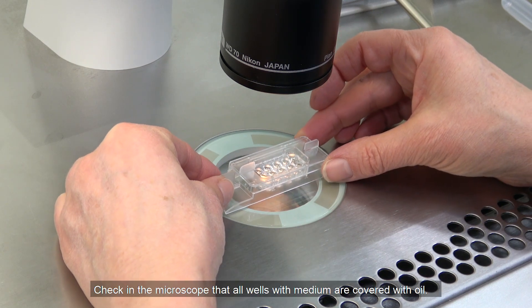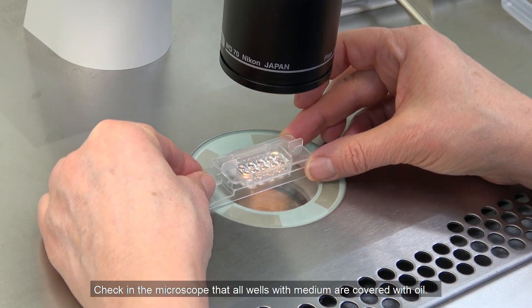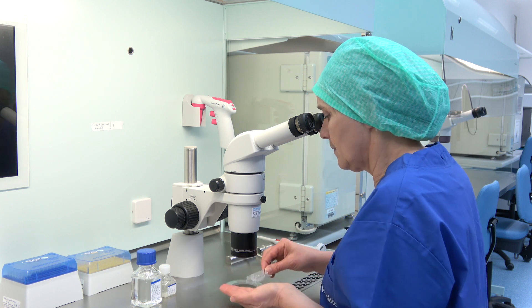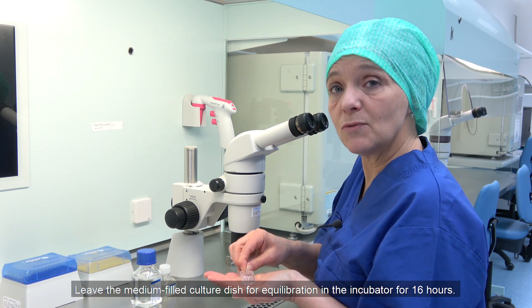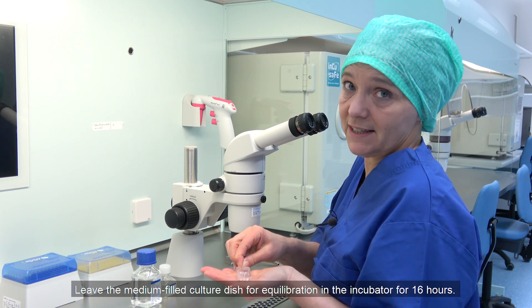Check in the microscope that all wells with medium are covered with oil. Leave the media-filled culture dish for equilibration in the incubator for 16 hours.